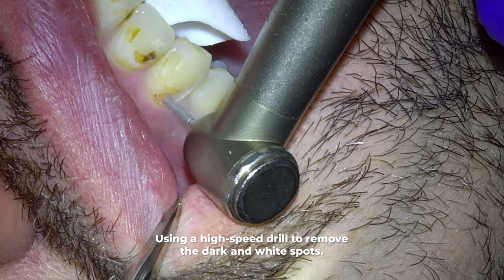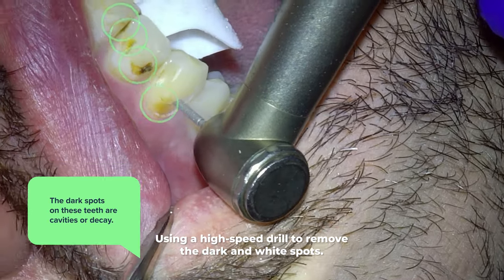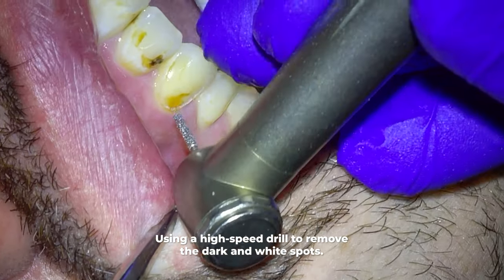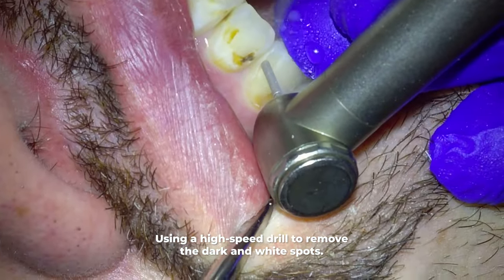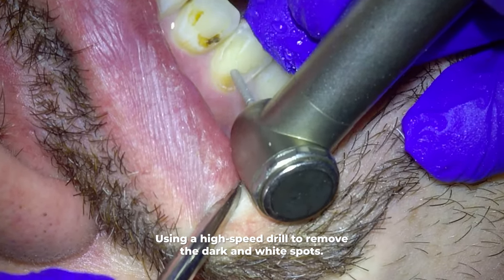We start by taking my drill and just removing the dark spots. The dark spots on these teeth are tooth decay, or cavities. We can tell this is a cavity because it's dark and then it's sticky to the touch with my little dental explorer. So if it's dark and sticky, it's pretty much tooth decay.